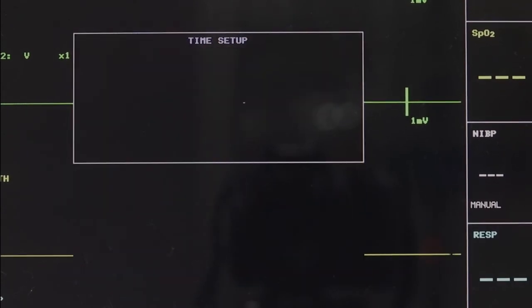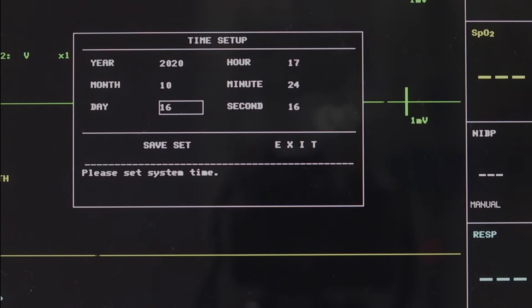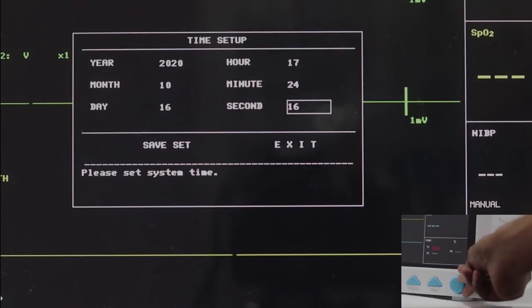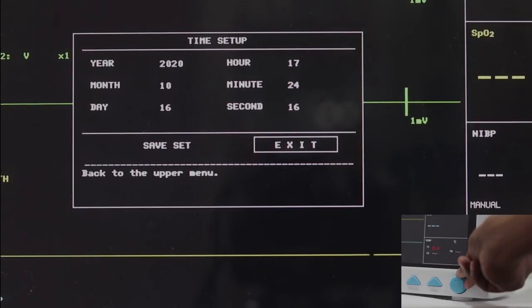Time Setup: System Time is in the format of year, month, day, hour, minute and second.